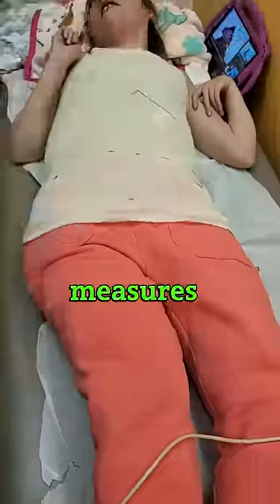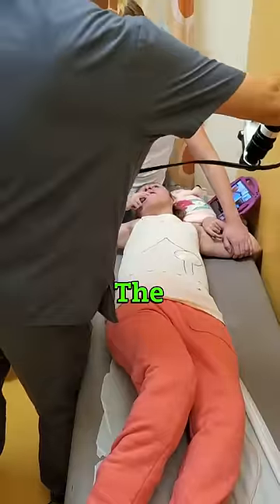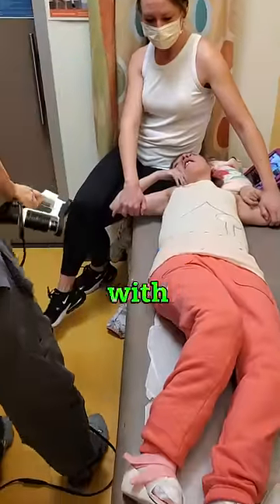First the doctor measures her tummy. Then the doctor draws where the feeding tube hole should go. The doctor takes pictures of her body with a special gun.